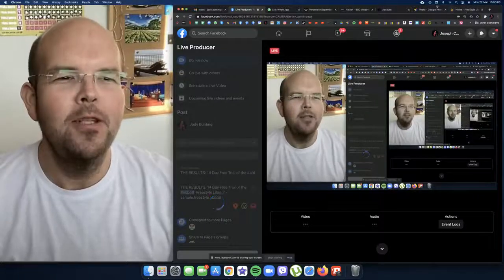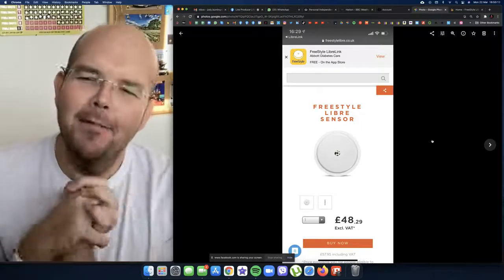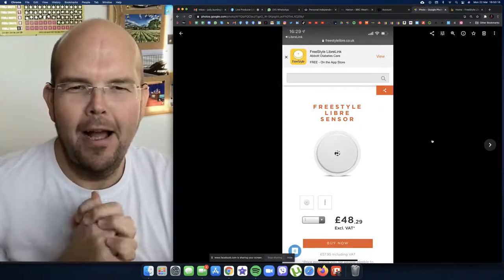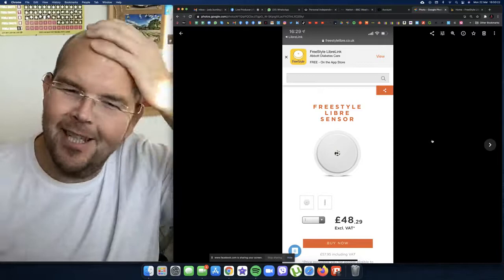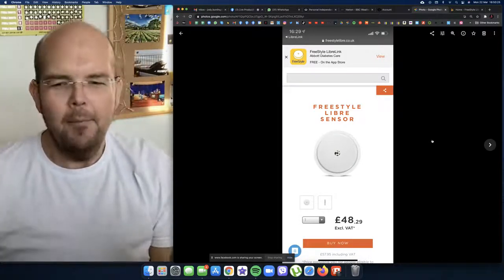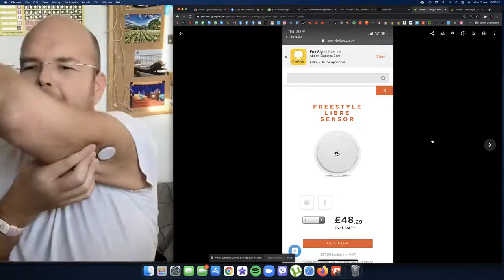Hi and welcome to today's Food for Thought live video. My name is Jodie Bunting. We're going very technical today because I'm sharing my screen with you, and I'm going to share with you the results from my Freestyle Libre.